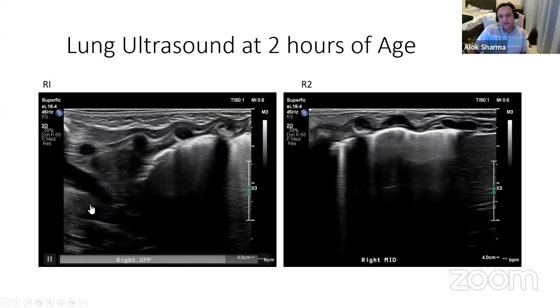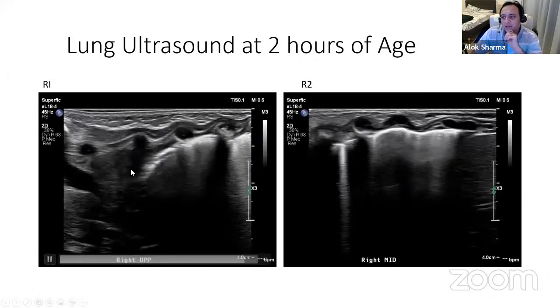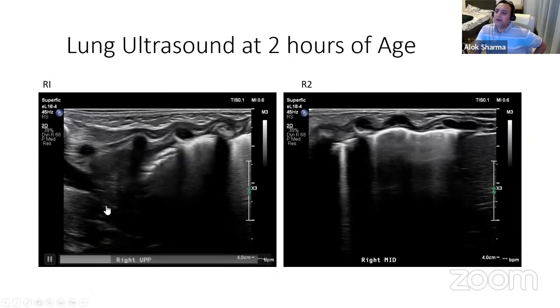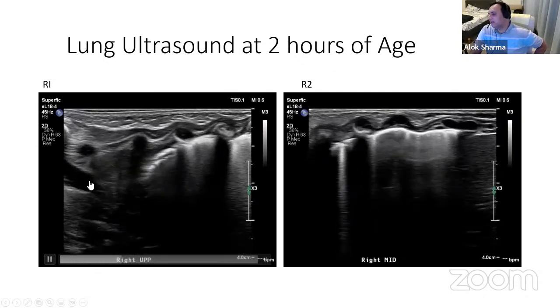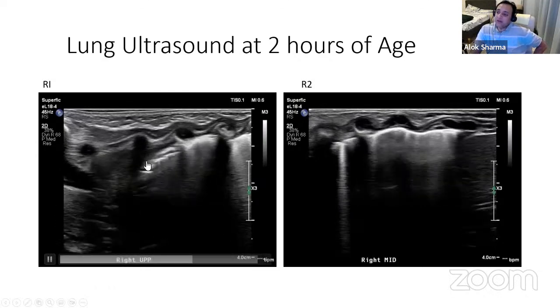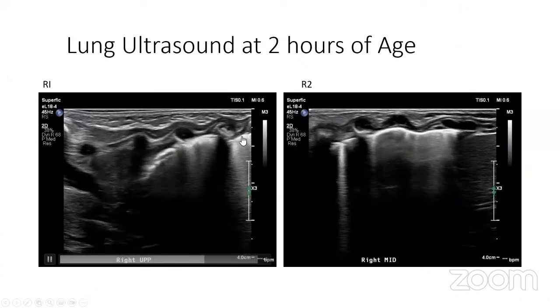The reason for wanting to show you this slide is that we'll be talking a lot about collapse and consolidation, in particular the right upper lobe. This is classically the thymus, and it gives you a tissue sign, which sometimes people worry looks like atelectasis, because you can't see a pleural line if you look at my cursor. But actually, this is thymus, and it also shows a lung pulse. You're absolutely right. Another rubbish image from Dr. Sharma, as usual. So clearly, the pleura looks a little bit irregular.